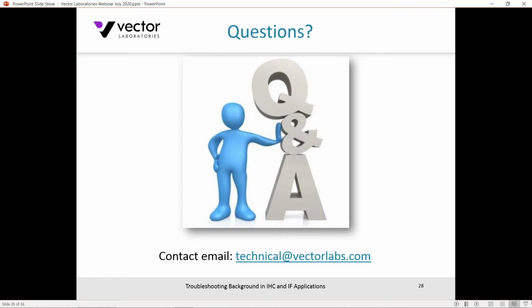Thank you. The next question is about deletion controls. What are you deleting with the second control? I thought the first was deleting the primary antibody, and the second deletion is deleting the secondary antibody. Right, so with the schematic we have, I had the primary, the secondary, and of course the enzyme substrate. So the first deletion control would be to apply only the enzyme substrate, and what we're deleting is the primary and the secondary in the schematic that I presented.